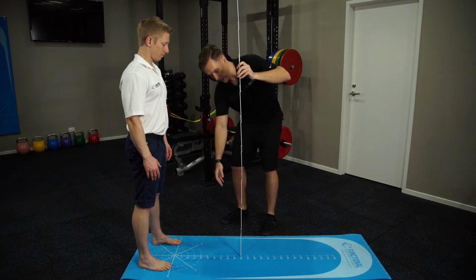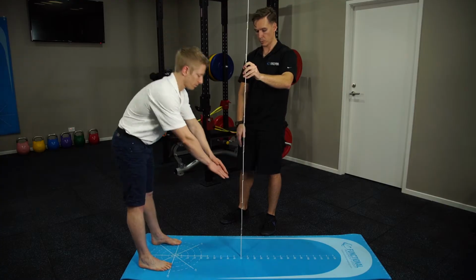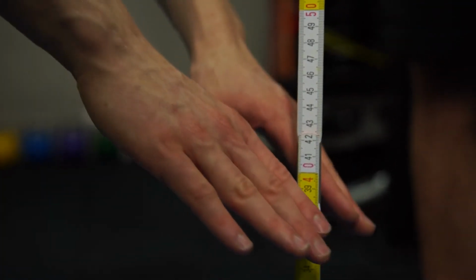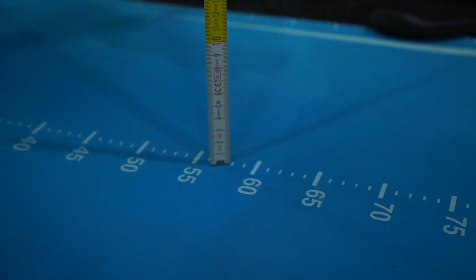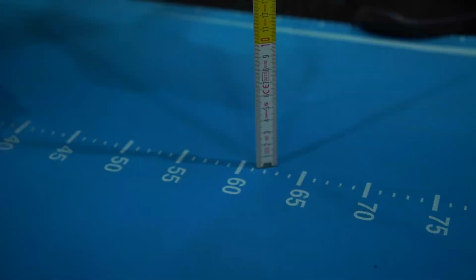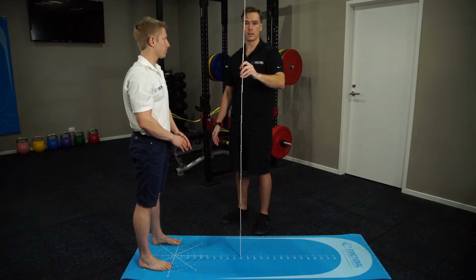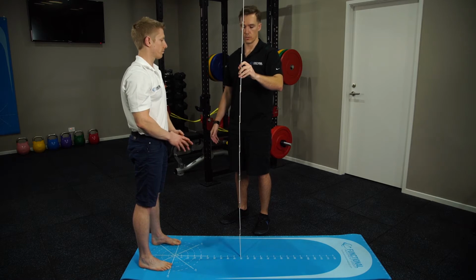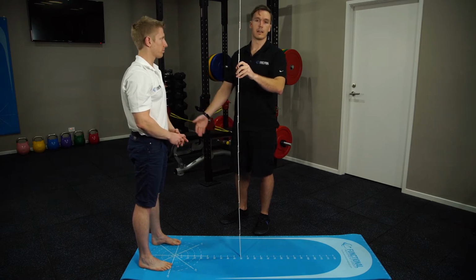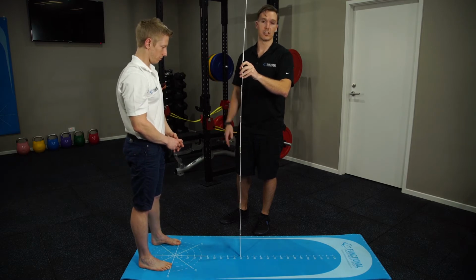By picking a verticality to start with and then asking the patient to reach towards that verticality, we can then assess not only how they move if we space that out a little bit further to increase the distance and check how far they can reach in that angulation, but we can also then assess the quality of the movement through there.